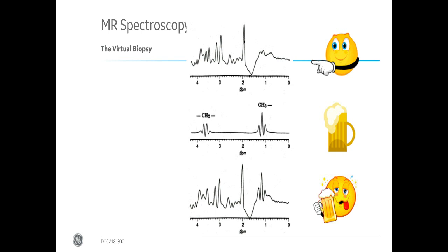And then we let the participant drink this bottle of wine and put him into the scanner. At first the volunteer is drunken, but that's not the problem here. So we acquire again a spectrum, and we see a spectrum that is really the composition of the normal spectrum before he drank the bottle of wine and the alcohol. So we can clearly identify the peak of ethanol in the brain now, and it is just overlaid. This peak is not overlaid by others, so we can identify the alcohol. And that makes it really different to imaging.